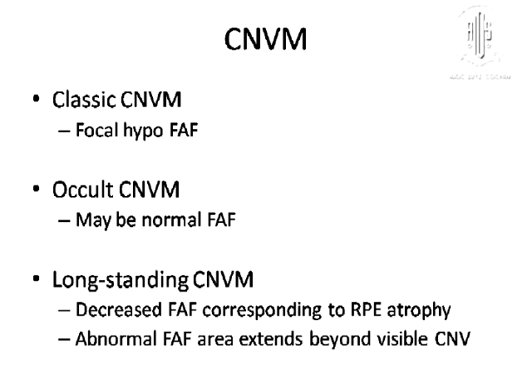Classic CNVM, there is focal hypoautofluorescence. In occult, there may be a normal autofluorescence also. Long-standing CNVM, decreased autofluorescence corresponding to retinal pigment epithelial atrophy. Abnormal fundus autofluorescence area extends beyond the visible CNV.